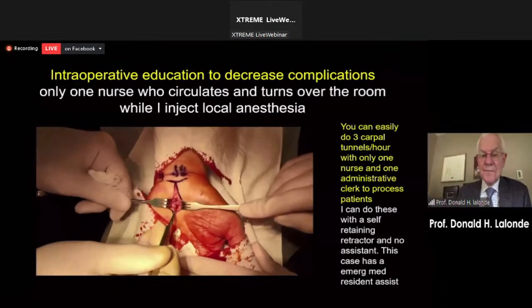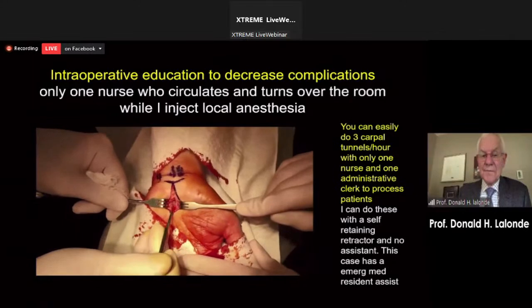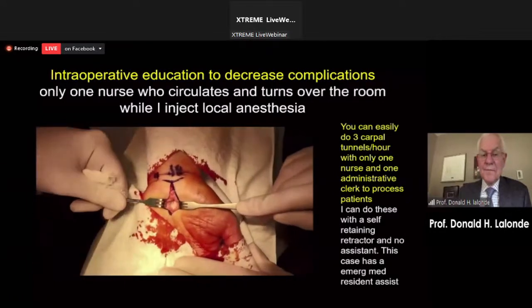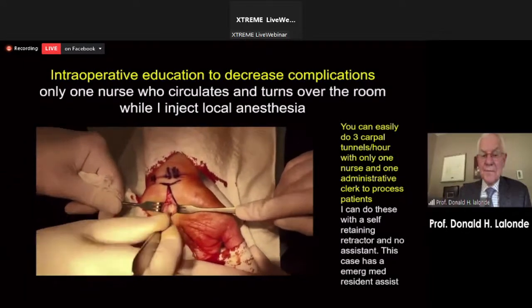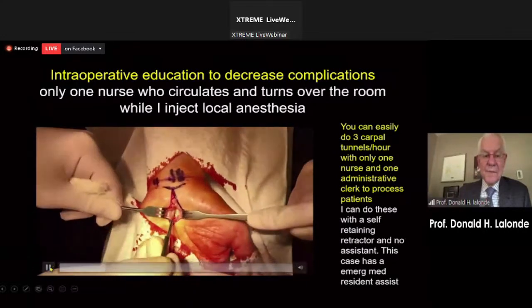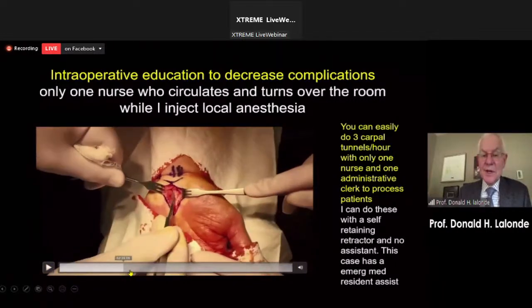Yeah, and you can sometimes feel the sound of the grit. Feeling the sound is something that is hard to understand unless you've actually had this operation, but I have had this operation, so I know what it feels like. So here we go until we see that fat pad nicely pouting out like that. So you can see that there's a little blood. This is not bloodless surgery, but you can see very well. And really, it's not that big a deal to do.